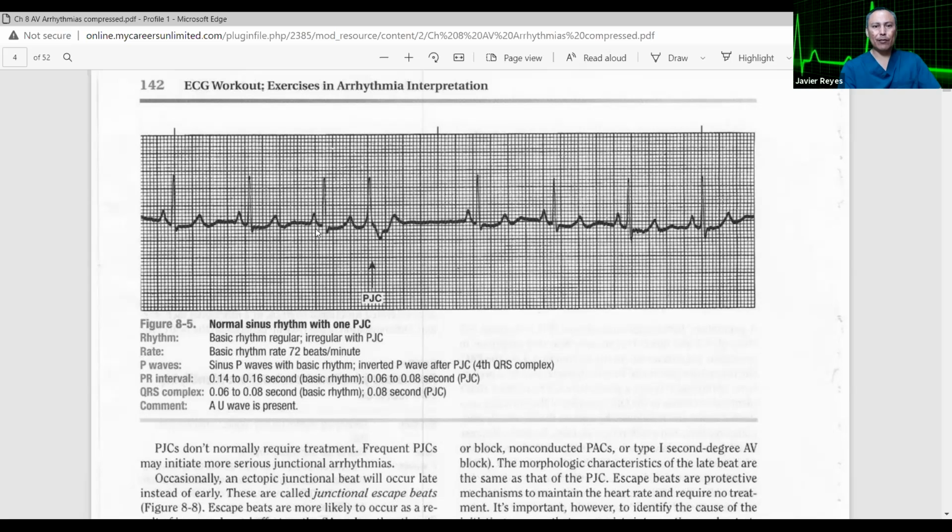So you have your P, QRS, and then T, and then nothing here, QRS, and then boom, a P. You should have an S wave here, which would be something like this, and it goes back up to the isoelectric line, and then your T wave. So you did identify the right one.